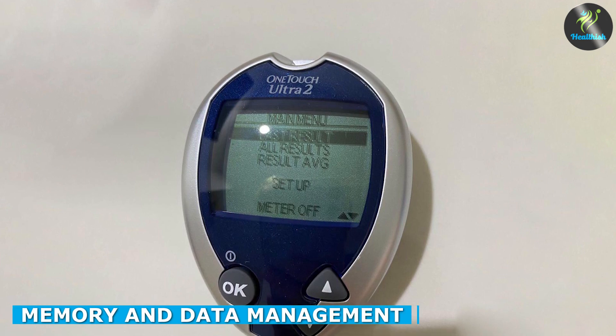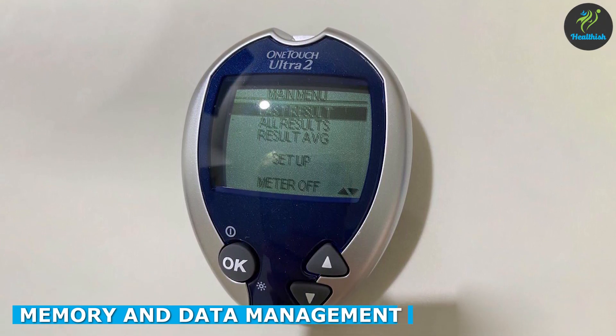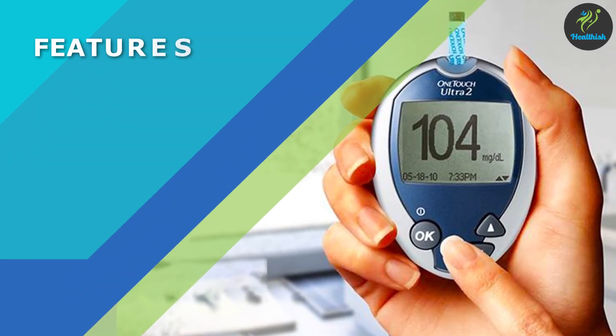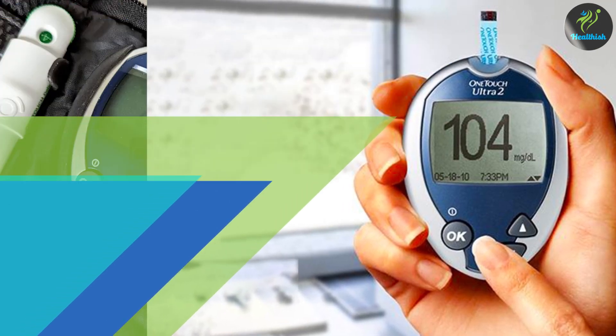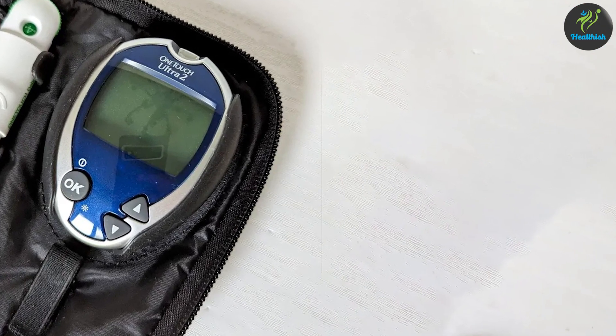The OneTouch Ultra 2 offers a memory function, allowing you to store and review your past blood glucose readings. This can be beneficial for tracking trends and monitoring your diabetes management progress over time. However, it's worth noting that the memory capacity may vary, so it's important to regularly transfer your data to a separate logbook or digital platform.